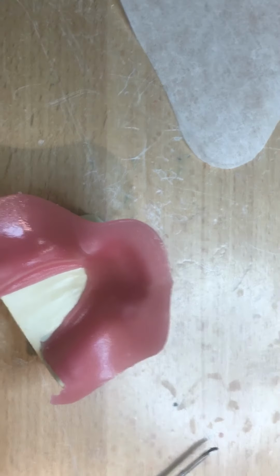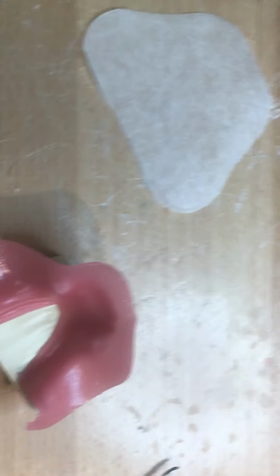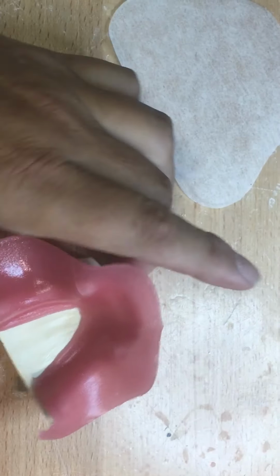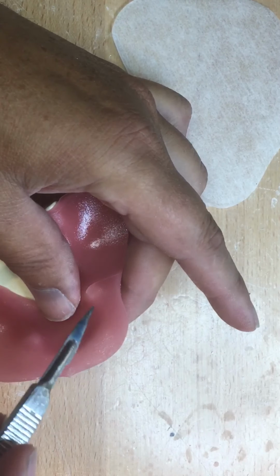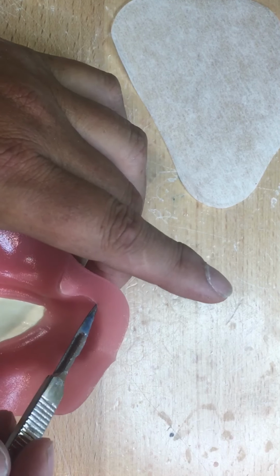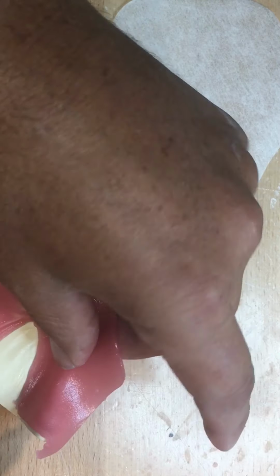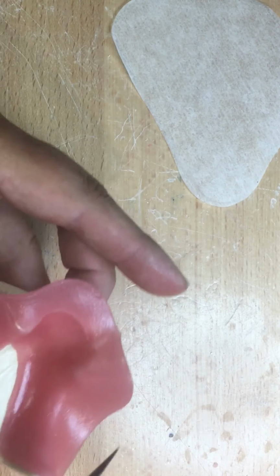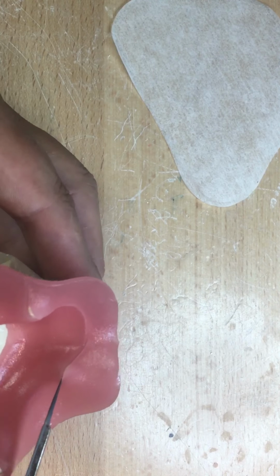I'm just going to lift this up a little bit higher so I can see what I'm doing. There we go. I can almost see my pencil line through the base plate. Again, the base plate's not a finished product. Some people like to create a career out of this base plate procedure. The base plate is a tool that we're going to use to get correct registrations.